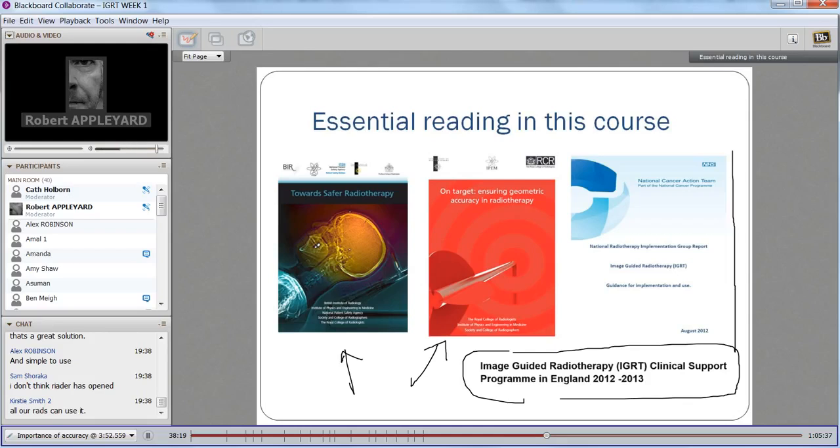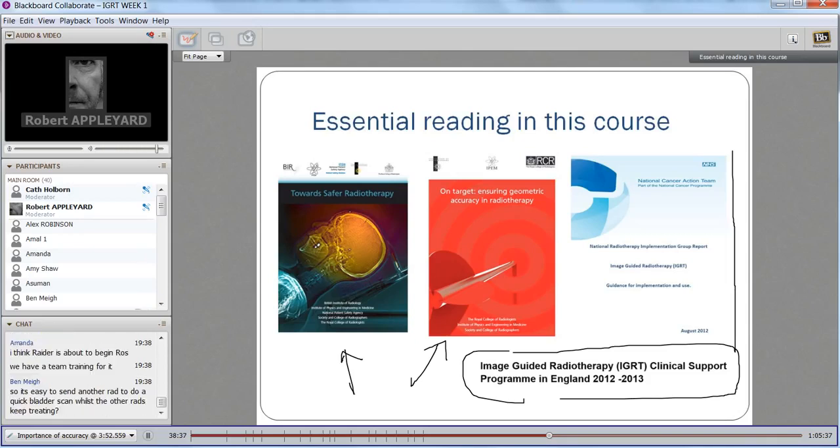There were a few points earlier that people have made about dose. I can't remember, there's a lot to go back through, and I think they've all scrolled off my screen now, but there were some issues that people raised about dose. I don't know if anyone else wanted to bring that back to the fore here. I think it was cone beam CT and issues with dose there. And clearly, this is potentially an issue if we are undertaking daily online imaging.